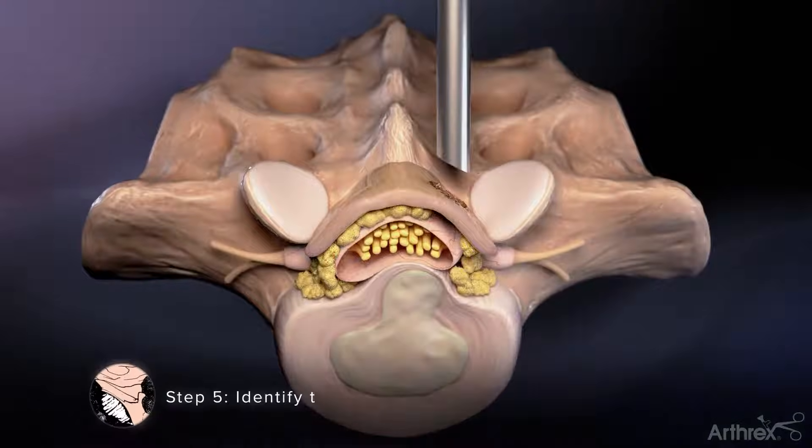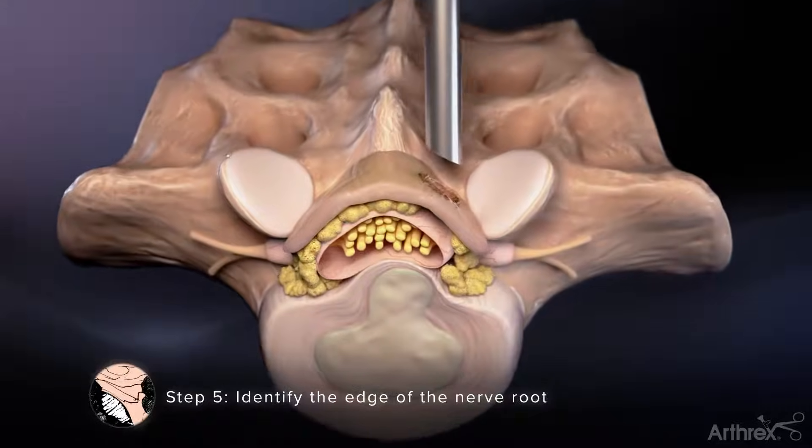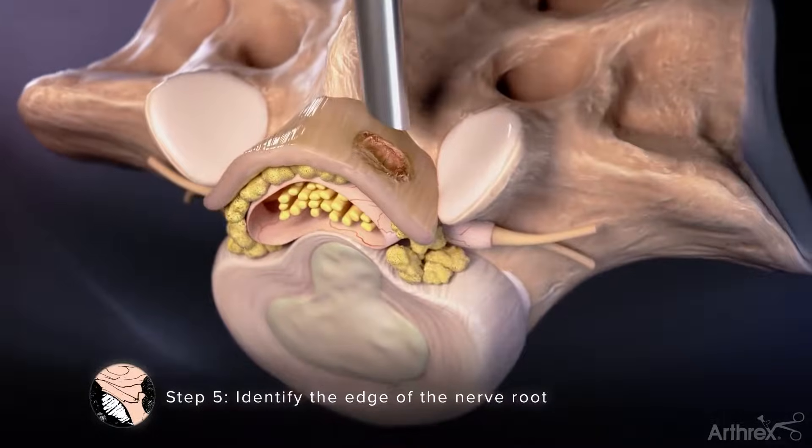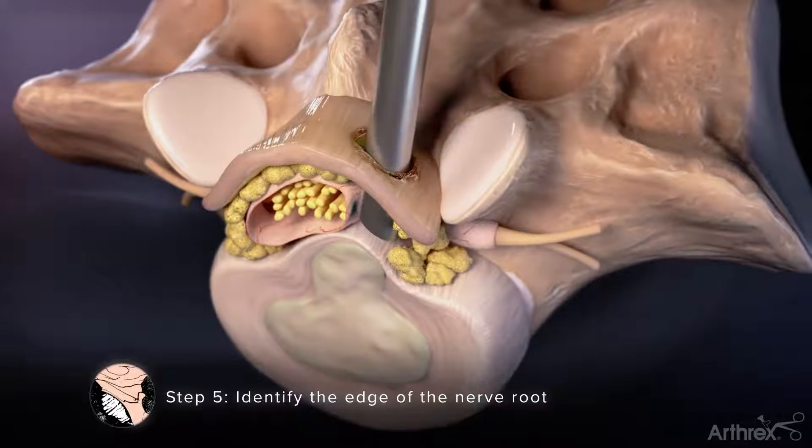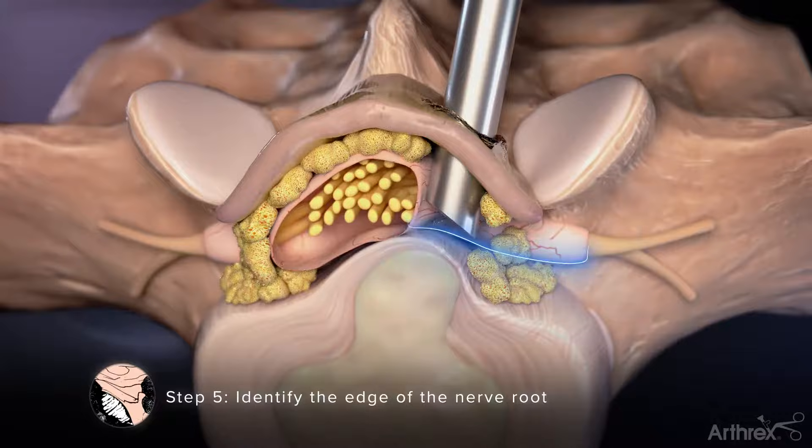Step 5: Identify the Edge of the Nerve Root. Once a sufficient amount of ligament has been excised, slowly advance the cannula through the ligament and into the spinal canal with the bevel of the cannula facing medial, allowing the edge of the nerve root to be clearly visualized.